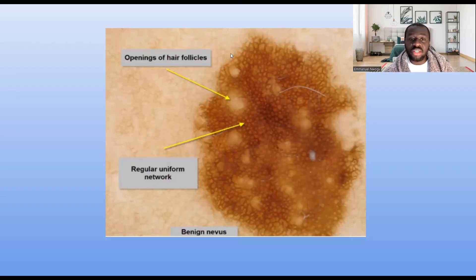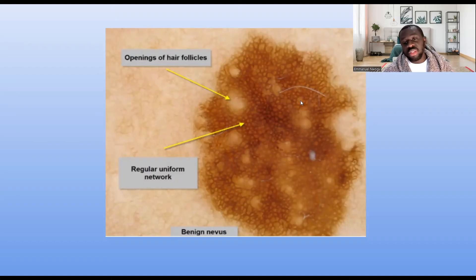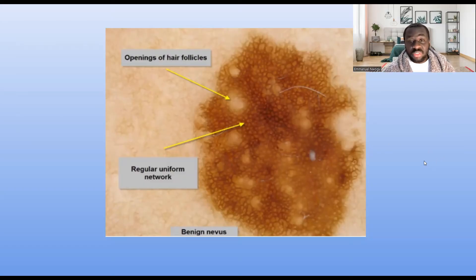You can see this pigmented lesion is symmetrical; if you divide it into two, it gives you two equal halves. It has a regular margin. It has a uniform level of pigmentation — these hollows here are the openings of the hair follicles, but if you exclude those, you'll see that the brownness is uniform and it has a uniform reticular pattern. When you place your dermoscope on this lesion, it confirms this is a benign melanocytic nevus.